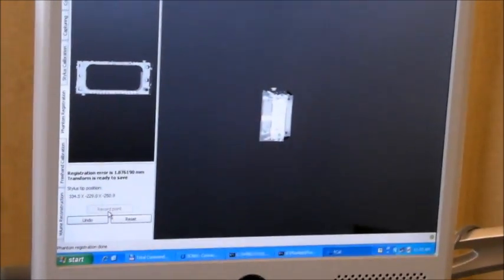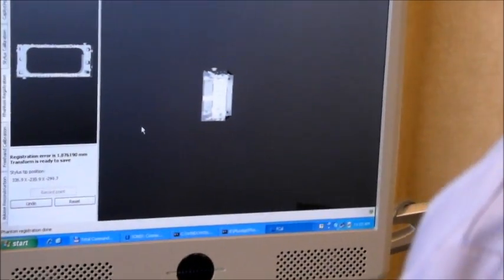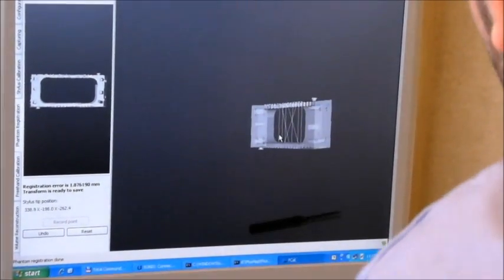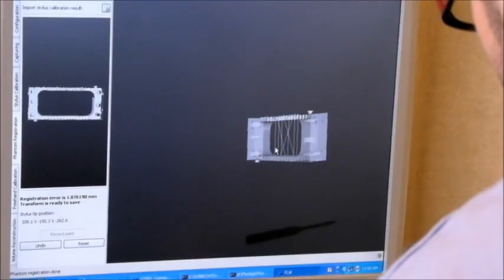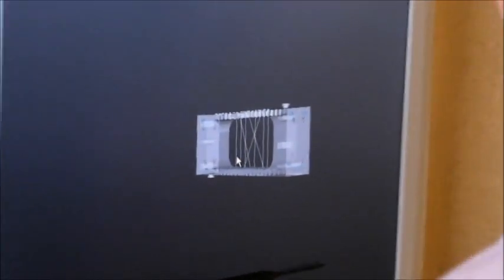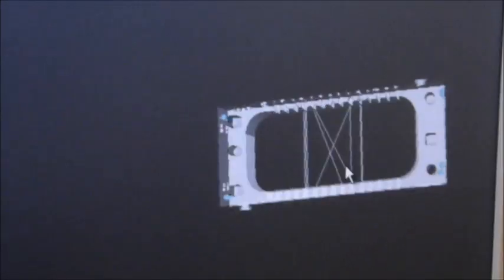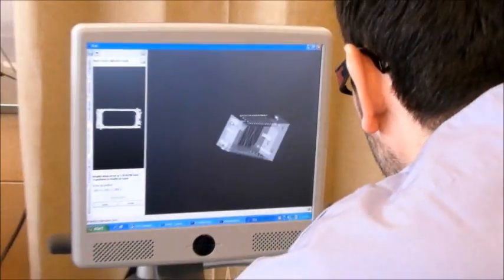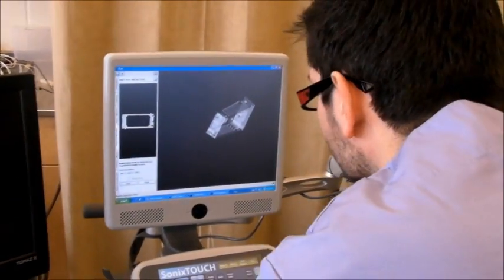You can see on the user interface the Phantom appeared, and you can check if the blue dots correspond to the holes in the Phantom. I think it's quite good.